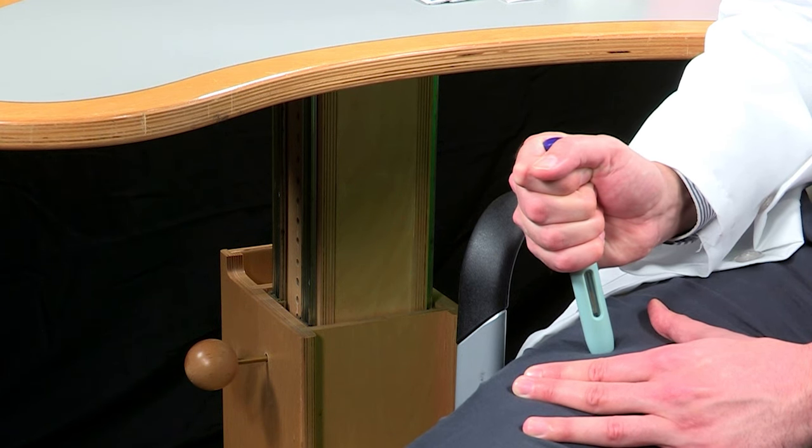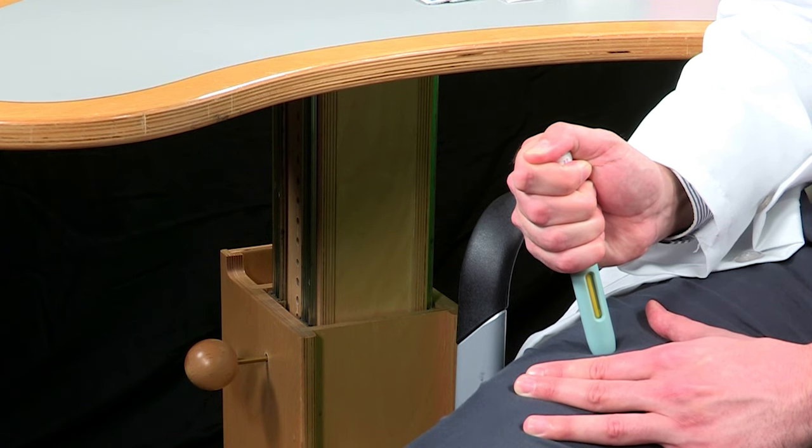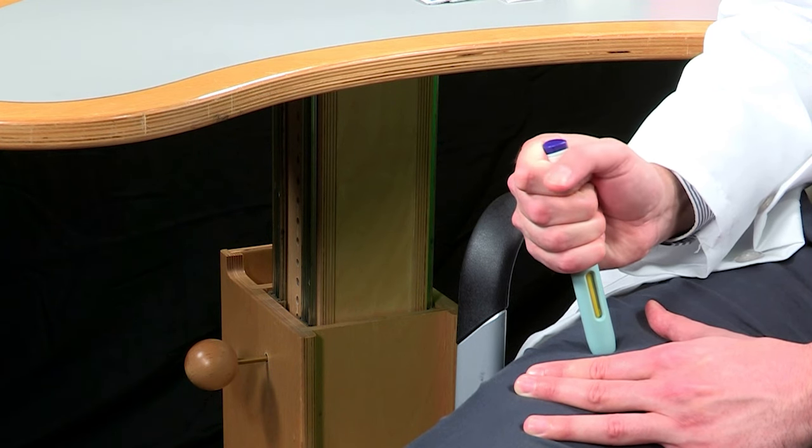When you are ready to inject, press the purple start button. You will hear a click. Keep pushing down on your skin. Then lift your thumb while still holding the autoinjector on your skin.